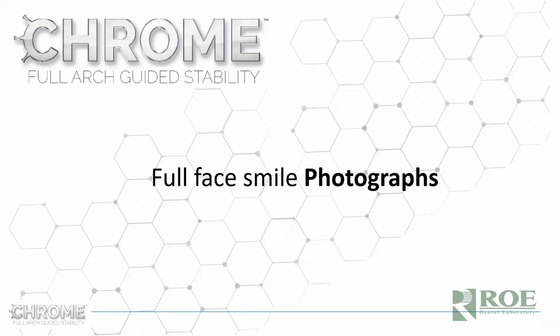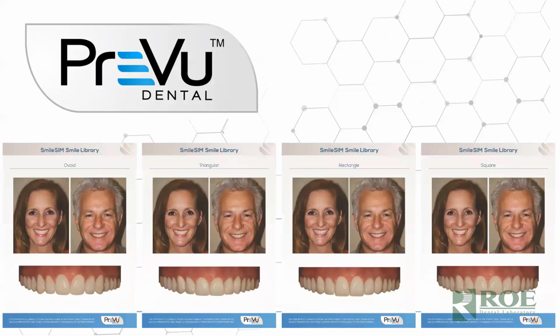So we really try to make a one-to-one smile simulation through to the prosthetic. And we do that through this preview system. We partnered with them a couple years ago, and they were nice enough to take STL files of denture teeth that we use to set, real denture teeth that we export as STLs to fabricate prosthetics. And they took their beautiful natural smiles and morphed them in the shape of our denture teeth.